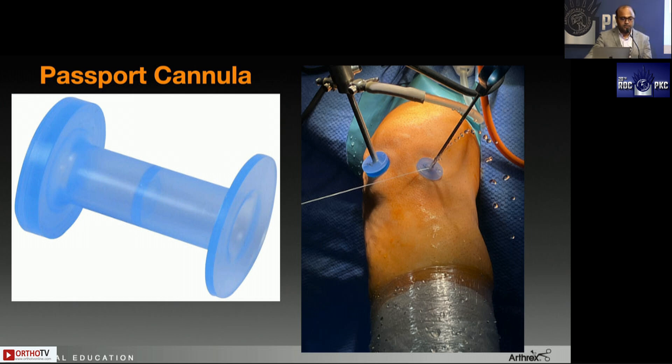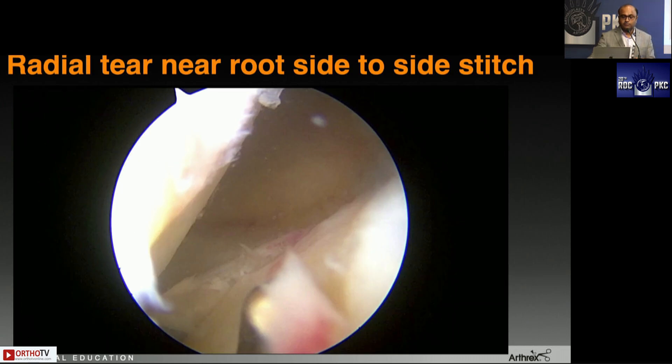The friend of the knee scorpion or the shoulder scorpion is the passport cannula. These are very unique devices with Arthrex — nobody else really has them. It's a flexible cannula that helps you do suture management very easily. It helps you shift the scope. You can put two passport cannulas — one for instrumentation — and since we keep shifting the scope into the medial portal to visualize the ACL footprint or for lateral meniscus work, you don't need to keep searching for the track.